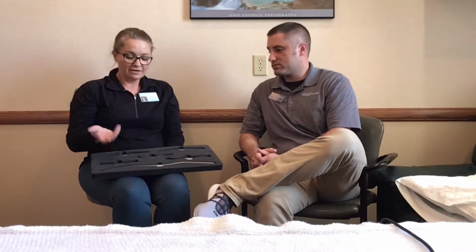So the good part is I can cover a large area very quickly with a form of massage. So this is just another form of massage. A lot of my patients like really deep tissue massage, and sometimes my hands wear out and I can't get as hard as they want. So these tools really help me get in there, especially on nooks and crannies or tendonitis where I'm really trying to get in there and dig hard. Also, I use some of these to do traction or mobilizations to certain joints too, and they work wonderful.